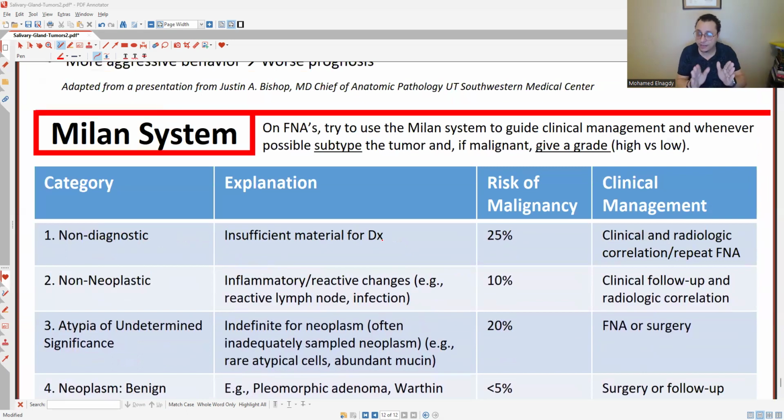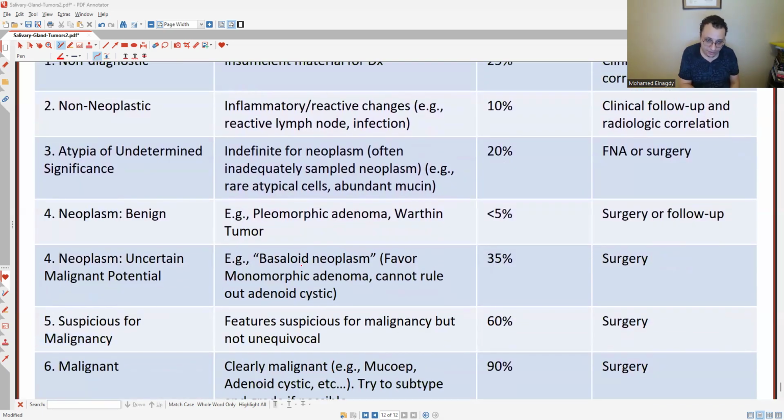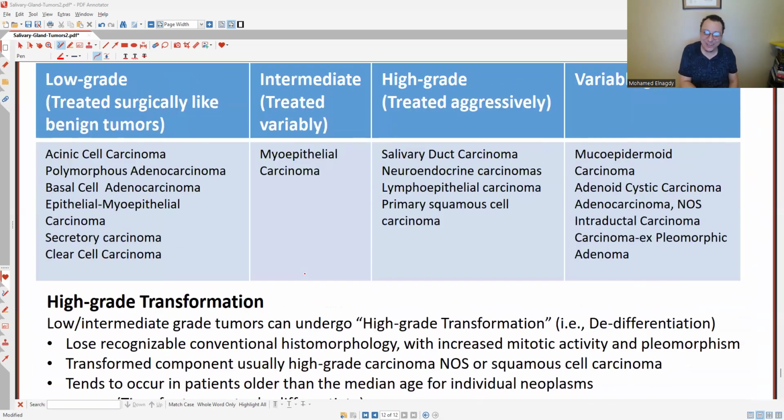And the same thing in the cytology for the salivary glands. They will give you a picture of pleomorphic adenoma and ask you what this is. You say pleomorphic adenoma, or what's the mutation in this, you select PLAG1. Or they will give you a picture of mucinous cells and epithelial cells here and there, so you would say this is mucoepidermoid carcinoma. I will show you all these in the cytology material that we will go over. There should be a lot of pictures. Boom, boom, boom, picture diagnosis.